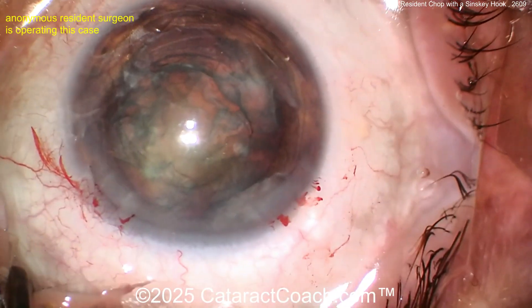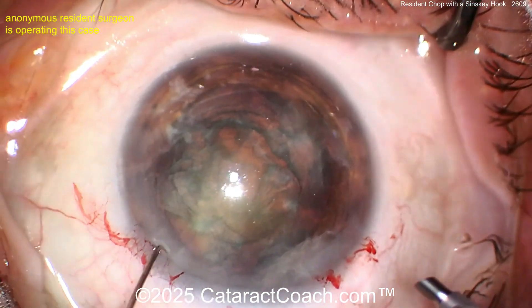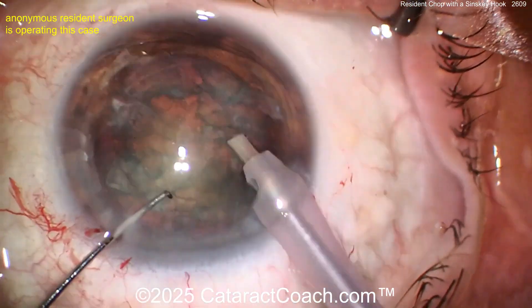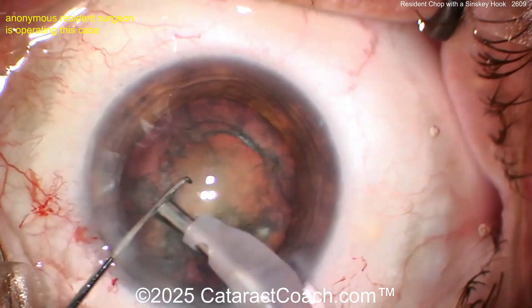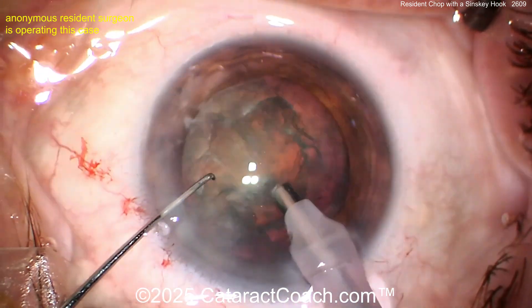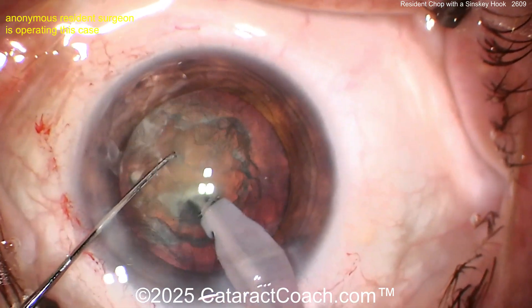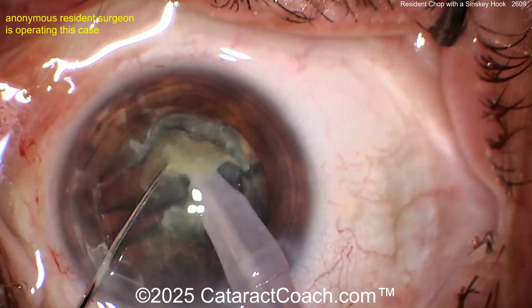There's a little bleeding from the incision, so maybe I was being a little too judgmental. Look at that — left hand only, a Sinski hook; right hand, the phaco probe — looks like a 2.75 millimeter sleeve. Sinski hook on the left hand. Here comes the phaco probe going into the nucleus — buzz buzz buzz — and then the Sinski hook for the chop. Use it like a vertical chopper. Pow — beautifully done.